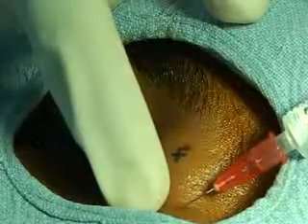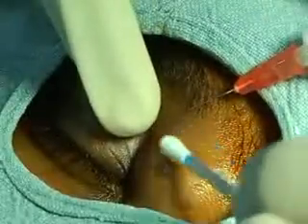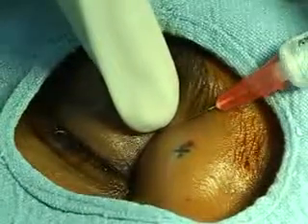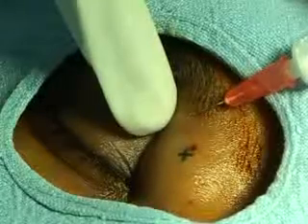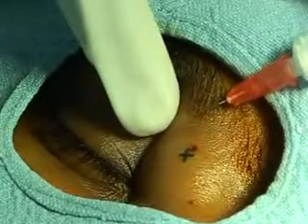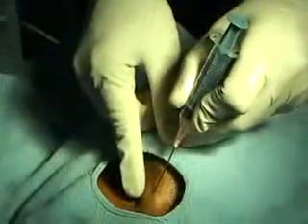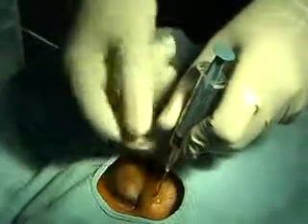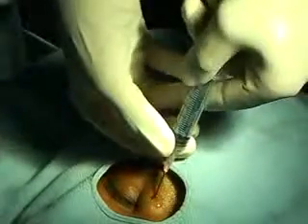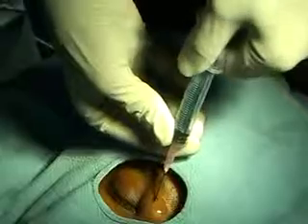First, the desired site of the stab incision is marked, and then 0.2 ml of 2% xylocaine with 1 in 100,000 adrenaline is injected into the overlying skin. A 3 mm stab incision may be made on the skin and orbicularis to visualize the cyst wall. Then, an 18-gauge needle mounted on a 10 cc syringe is inserted into the cyst, and the white material is aspirated until the entire cyst collapses.